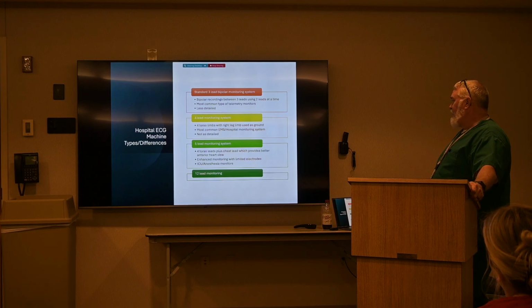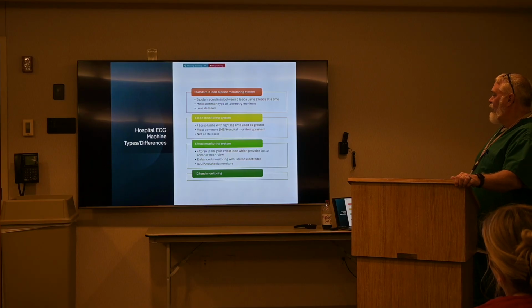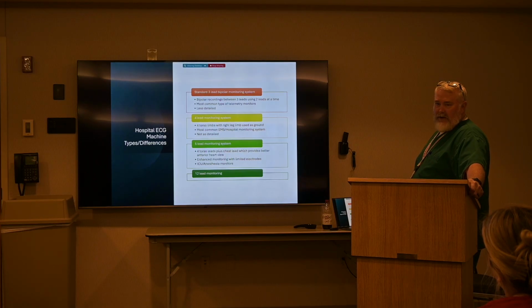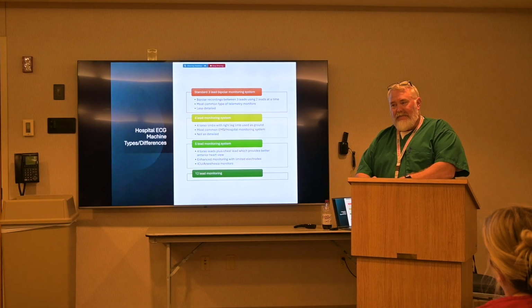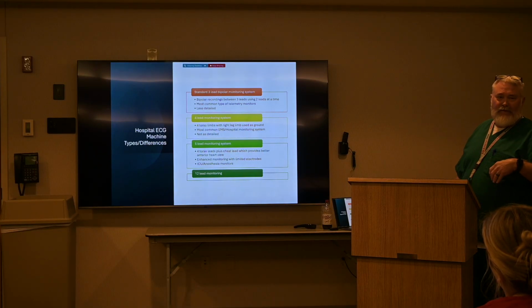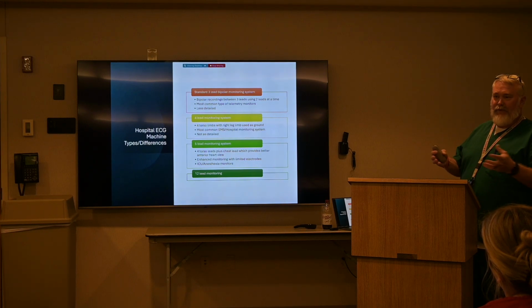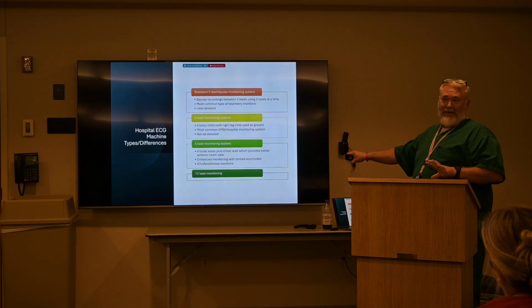The 5-lead monitoring system has 4 torso leads plus a chest lead, which provides a better anterior heart view. You see these in enhanced monitoring with limited electrodes, and then you'll see these in ICU units and anesthesia monitors. And then obviously the 12 lead, which is what we really use to identify problems, injury, electrical conduction issues. We're not going to talk about that in this class because 12 lead interpretation in itself is very complex with a lot of different things. So I may put together a class on that down the road, but we're not going to talk about that today.